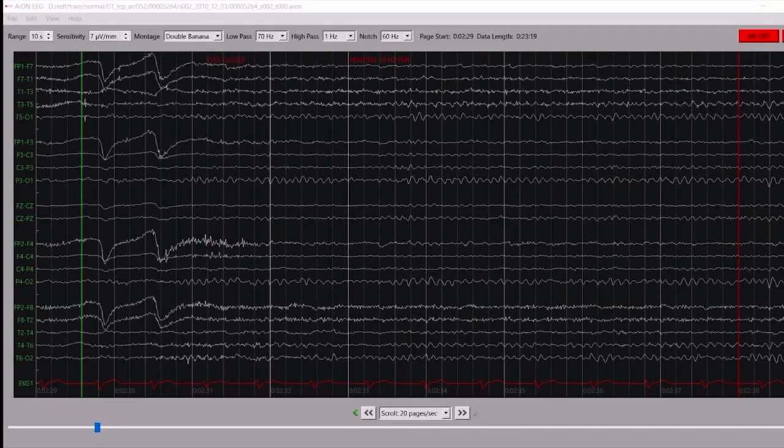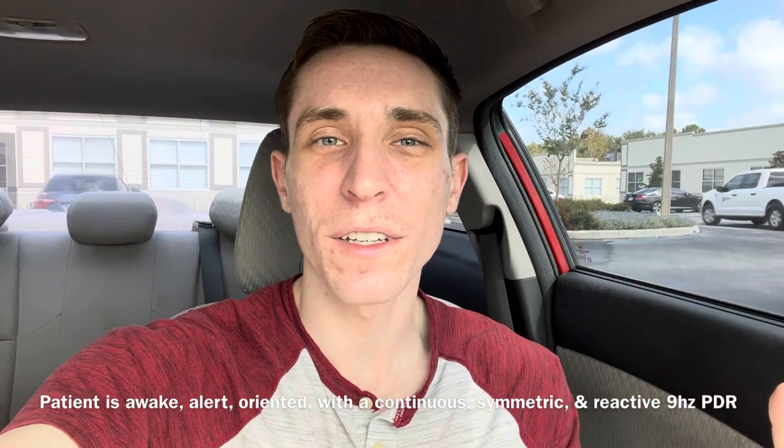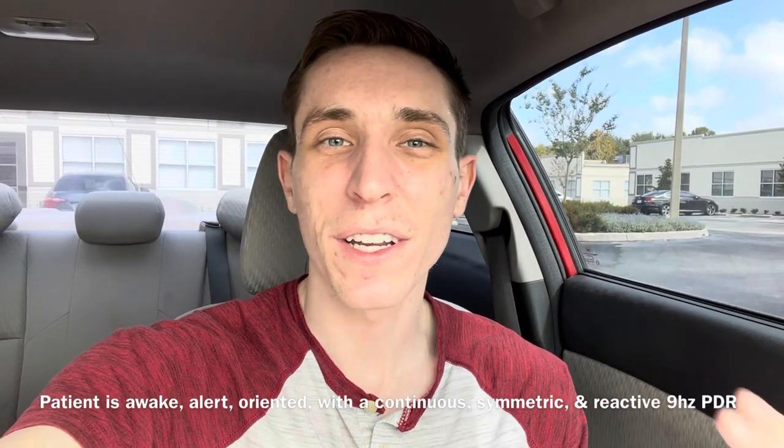The next major thing you're going to want to take note of is the posterior dominant rhythm. Is it reactive? You can just have the patient close their eyes, and you'll see a nice 8 to 12 waves per second in a normal patient. When they open their eyes, the 8 to 12 waves per second in the back of the head — O1 and O2 — it's going to disappear. That is a normal, reactive, posterior dominant rhythm. So to recap, for a normal patient you'd say: this patient is awake, alert, oriented, with a continuous, symmetric, reactive, 9 hertz posterior dominant rhythm.